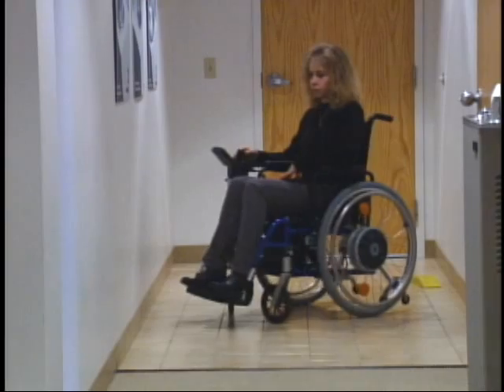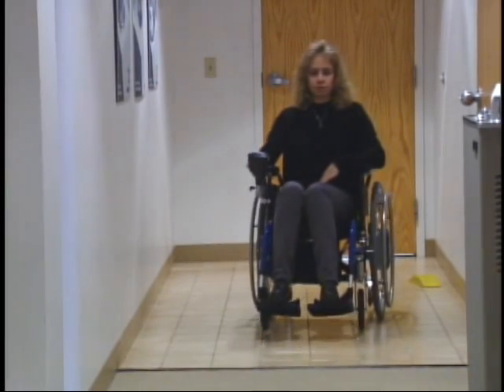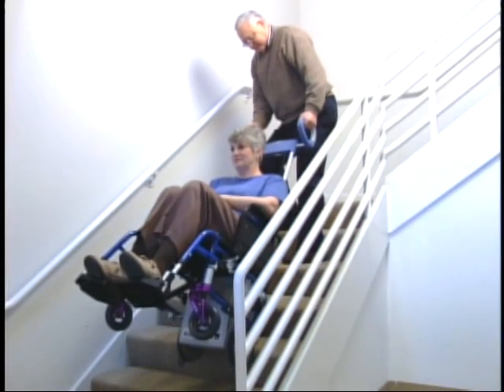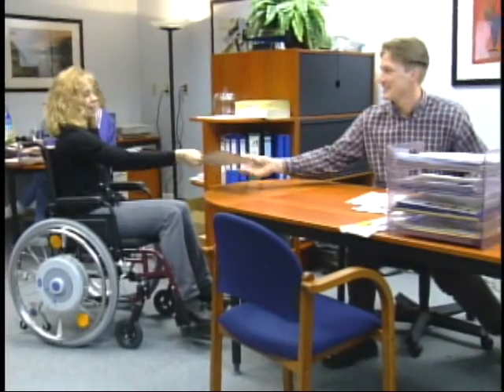E-Fix is a power conversion kit for manual wheelchairs. Scalimobile, a stair climber for manual wheelchairs. E-Motion, a power assist unit for manual wheelchairs.